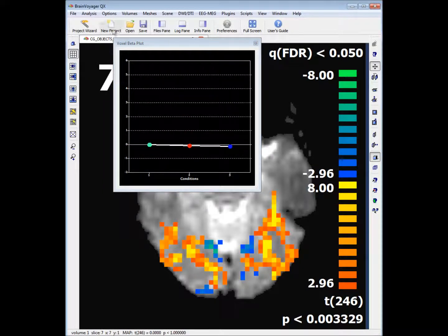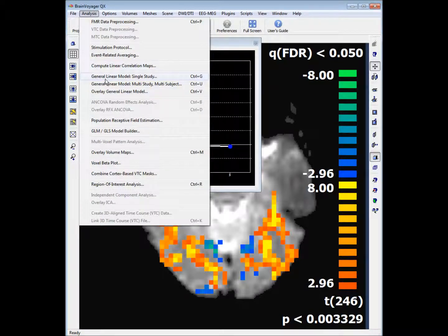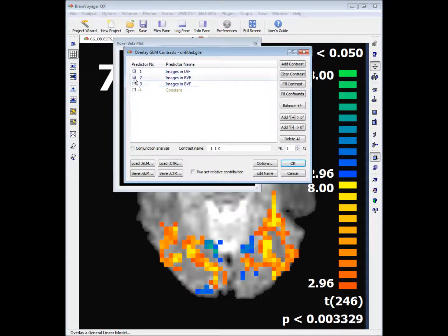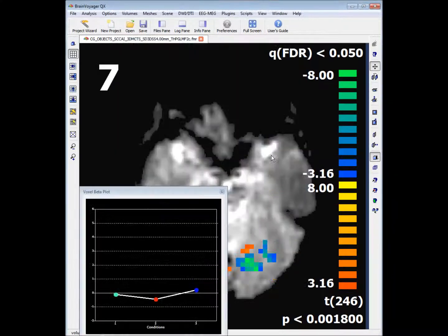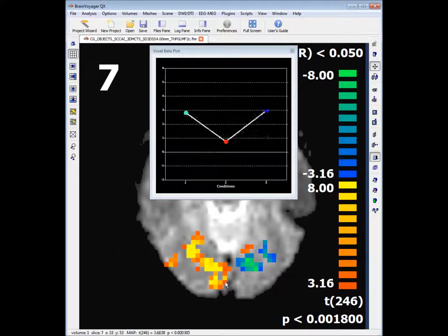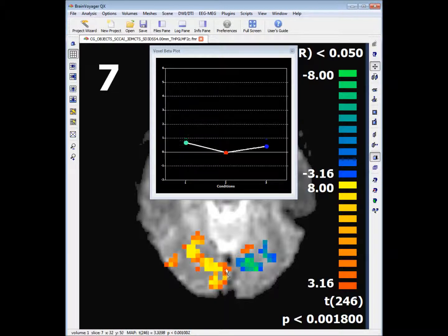We can also ask the GLM to show us regions where the activation for predictor 1 is significantly different from the activation for predictor 2, by having a cross for predictor 1 and a minus sign for predictor 2. If we hit OK, what we have are regions of activation that are significant for predictor 1 compared to predictor 2 — regions where predictor 1 is significantly different from predictor 2.